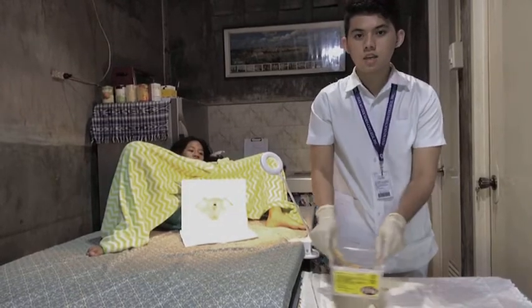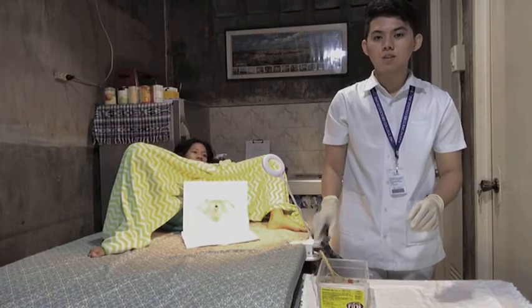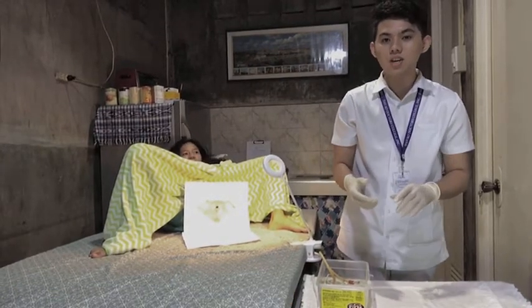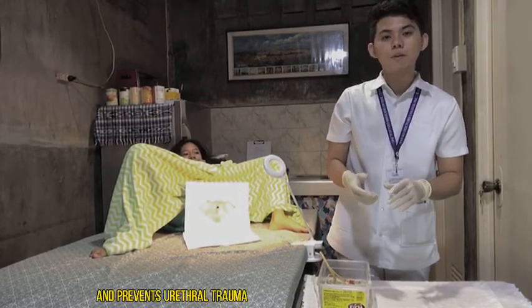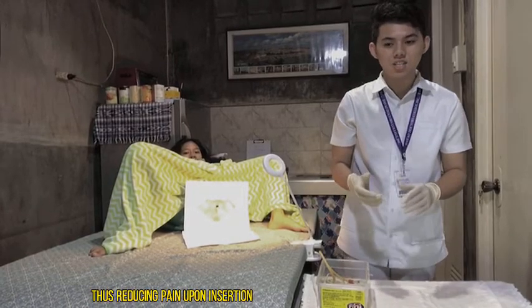Okay. So next, we need to lubricate the catheter for about 1.5 inches, being careful not to plug the eye of the catheter. This is important because lubrication reduces friction and prevents urethral trauma, thus reducing pain upon insertion.